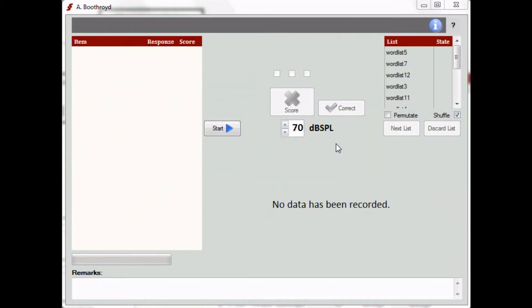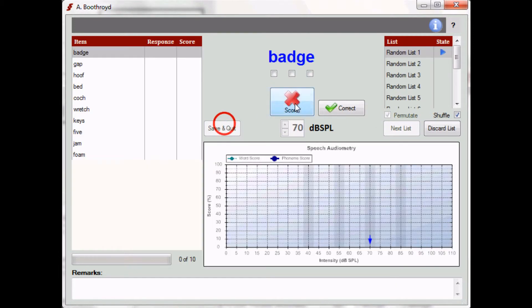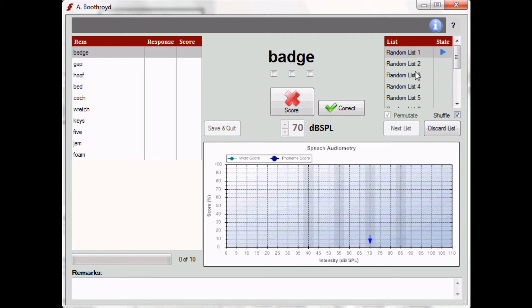If you check the permutate box, ACE will reconstruct new lists by randomly selecting words from different word lists. This feature is particularly helpful if you have only a limited number of recorded lists.